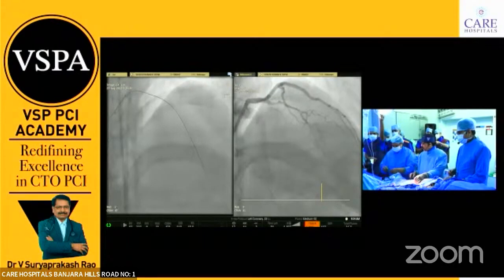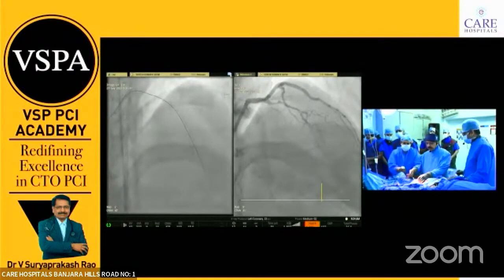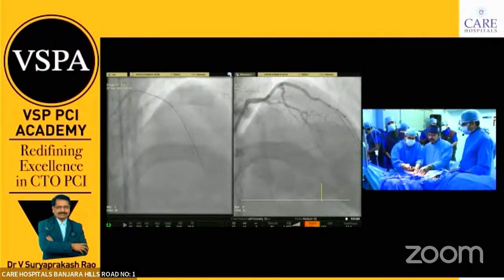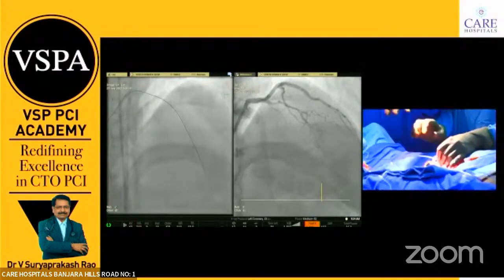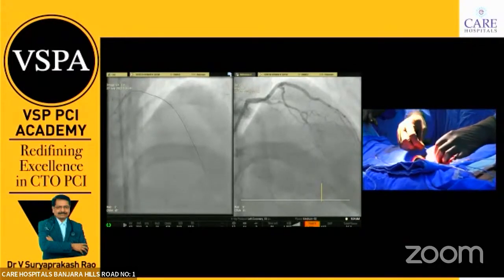This is the way we do a wire exchange in CTOs. It's a simpler way and a very perfect way not to lose the wire axis into the distal lesion. That's why it is a safe technique.